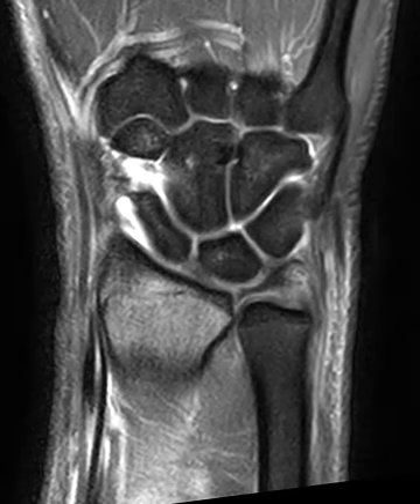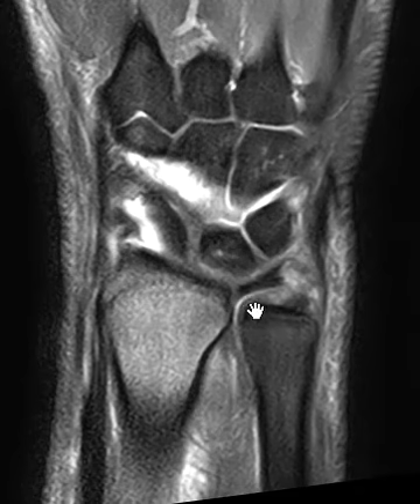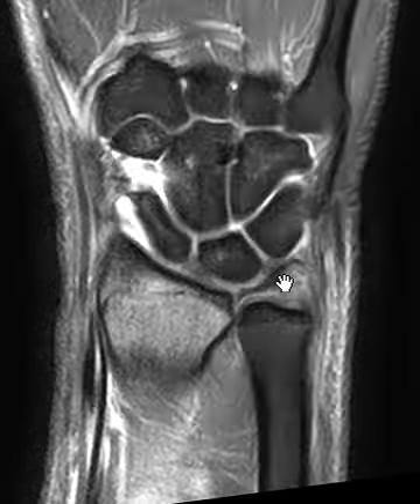It's related to the triangular fibrocartilage. So this is the radius, here's the end of it, this is the ulna. Above the ulna and coming off the radius we see this horizontal band which is the triangular fibrocartilage — it's like a little meniscus or shock absorber between the carpal bones and the distal ulna. Here this is the central portion — it looks absolutely beautiful. This is what we call the central disc, the middle of it here.